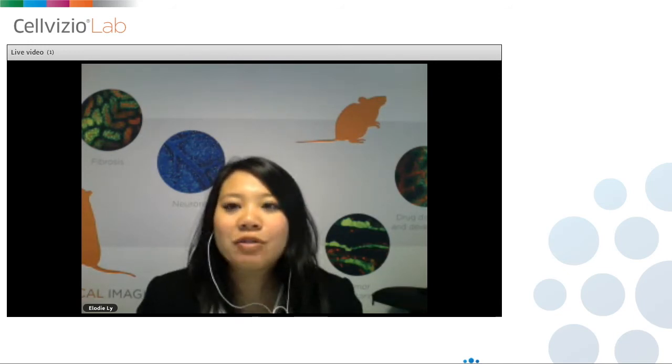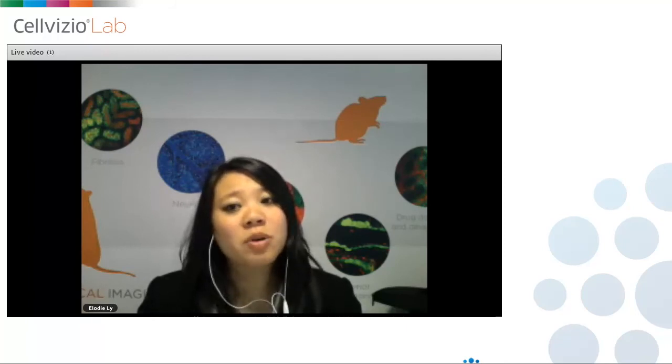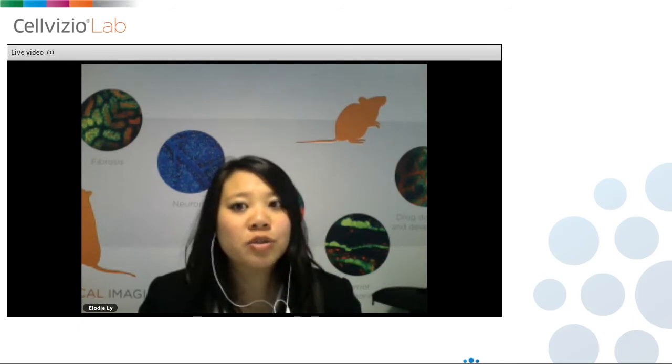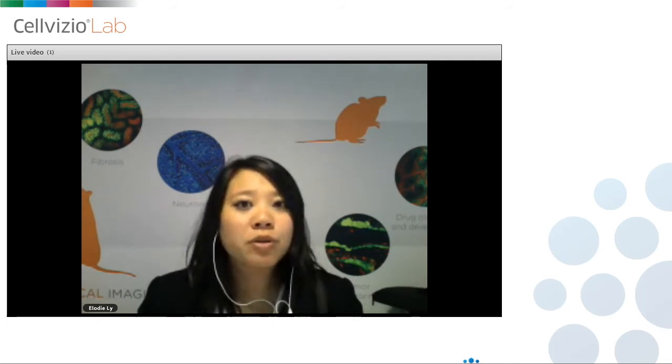Then I have another question, still regarding the different channels, whether it is easy to switch from one laser to another. Actually, our system will send the two laser wavelengths simultaneously. You have a set of mirrors that are used to scan the tissue using the confocal microprobe, and both lasers are scanned simultaneously.